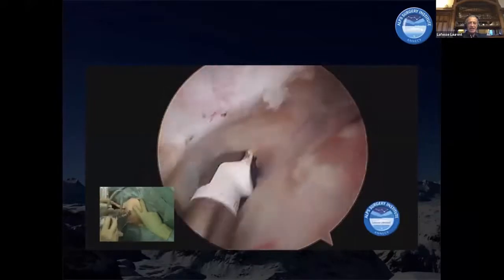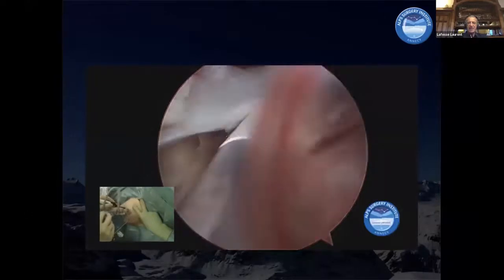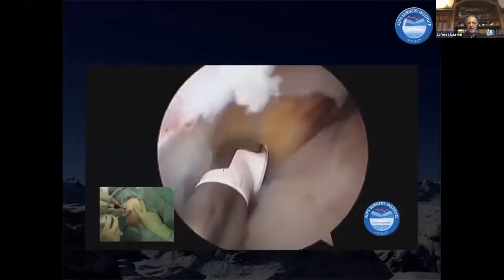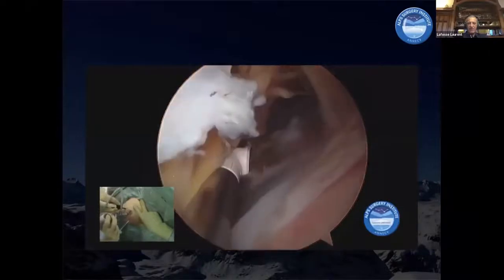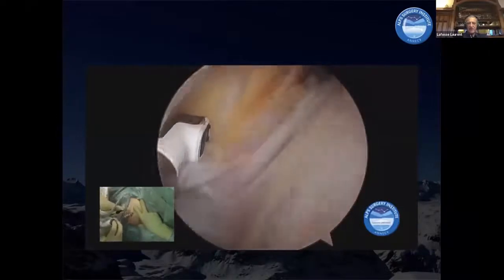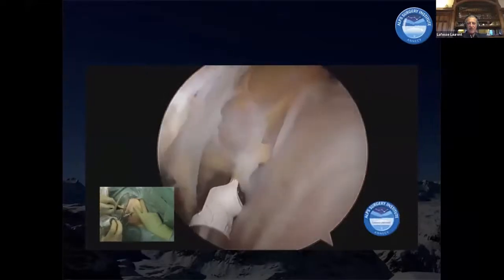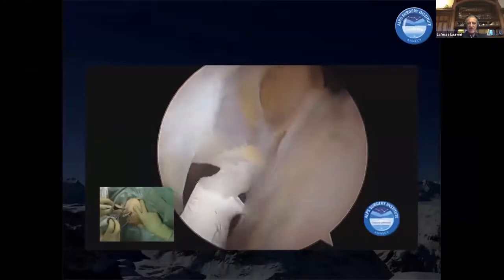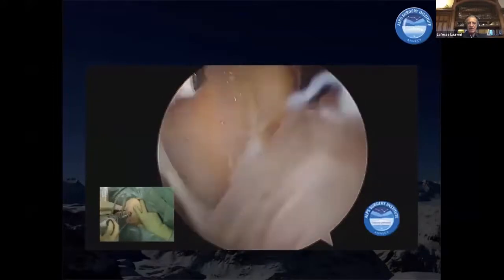But by chance, what you can see here is that the adhesion is easier to dissect the closer you go to the plexus. And here you have your total dissection, and here you bring your probe very inferiorly, you respect the fibers of nerves going toward the muscle, and you go inferiorly in order to repair this subscap without pulling the plexus together with the subscap.